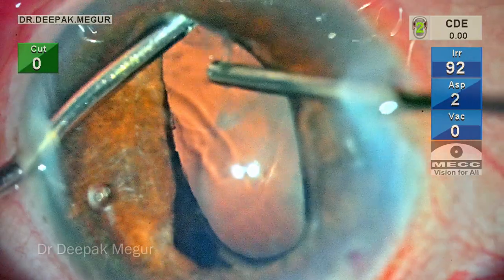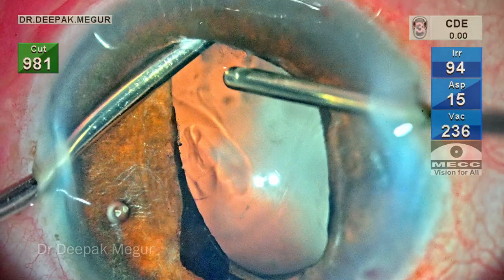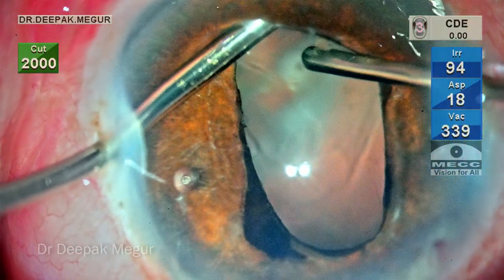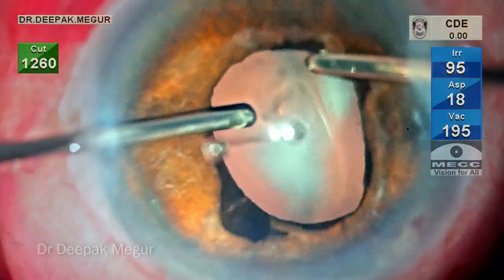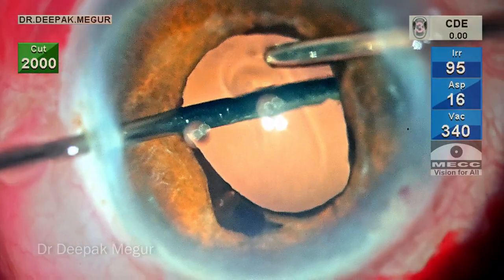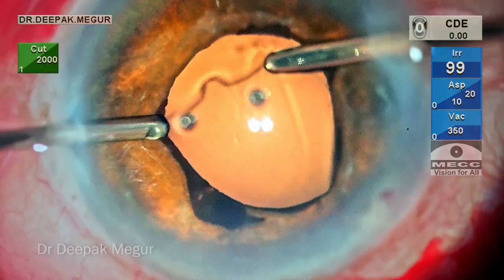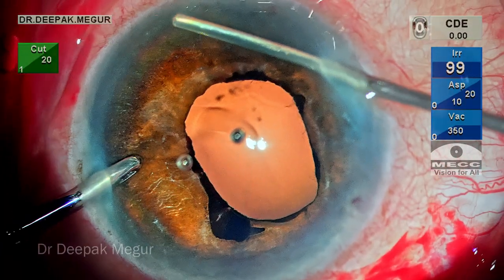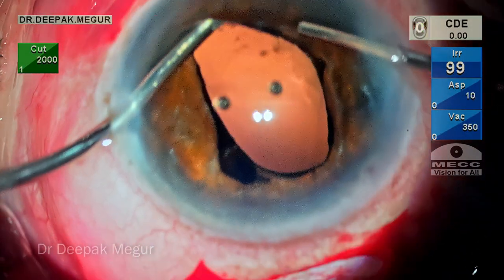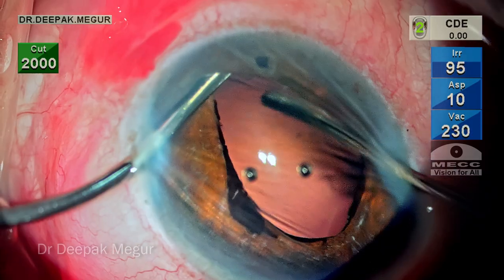A little bit more anterior vitrectomy in the retropupillary area, just to ensure that there are no more inflammatory membranes or vitreous around. Retracting the iris and trying to visualize any vitreous fibrils underneath it and taking care of every single bit of vitreous fibrils.